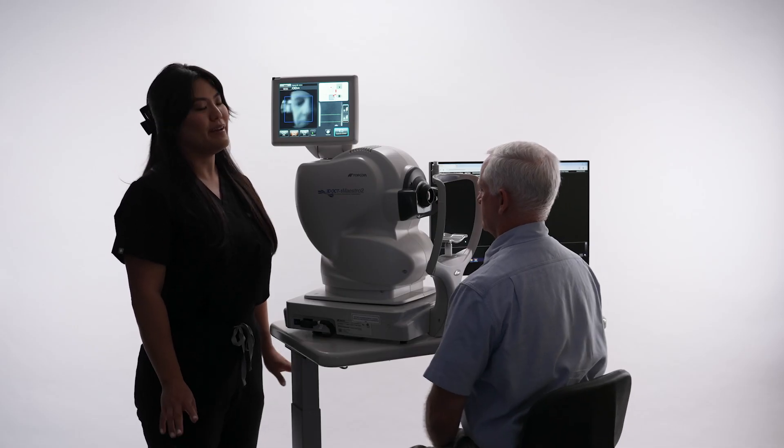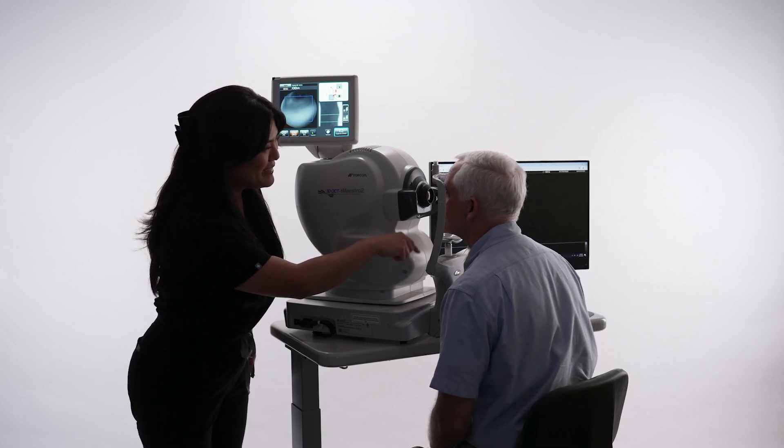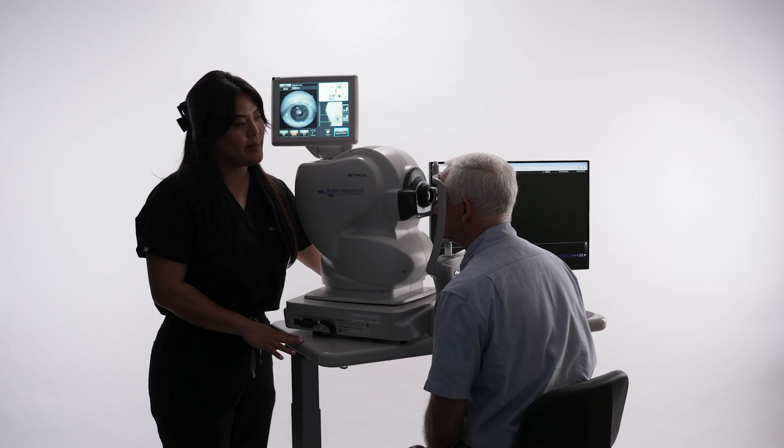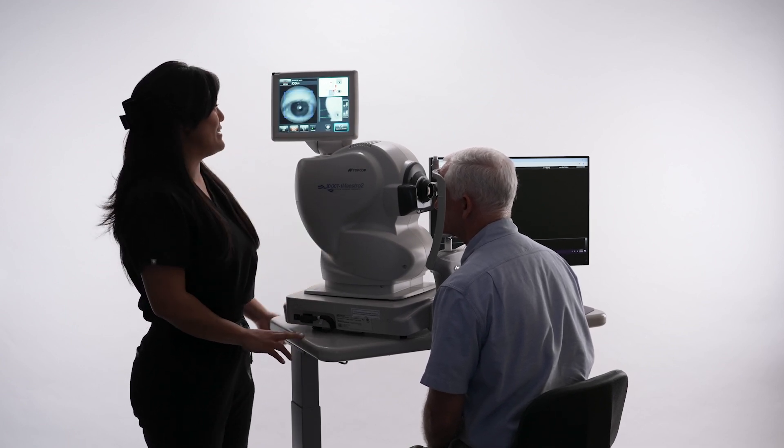Position the patient comfortably in front of the device. Ask the patient to place their chin on the chin rest and forehead on the head rest. You may need to adjust the table or chair to ensure the patient has a straight back and is comfortable.